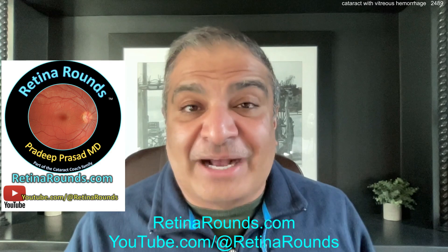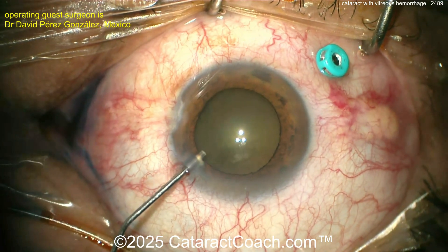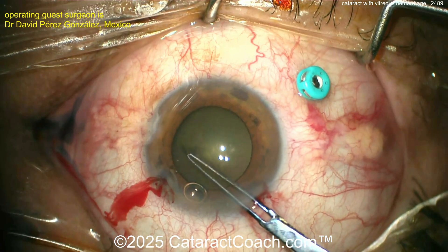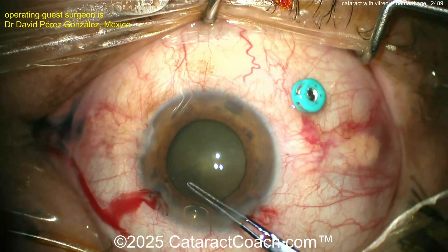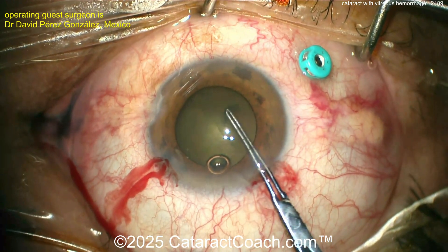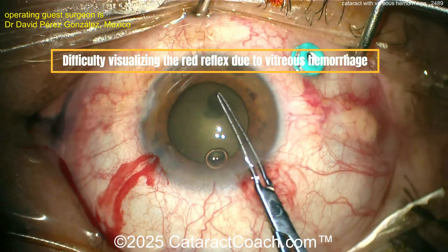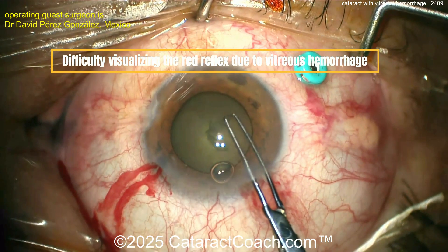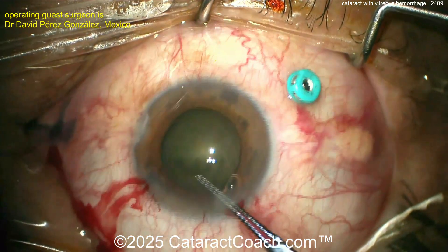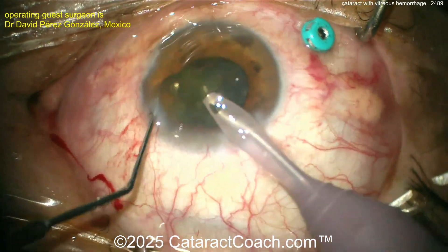Here comes our video of the day. You can see the patient has a real cataract. A trocar is placed pars plana, here comes the main incision, and the capsule has already been stained with trypan blue dye — you can see a little blue dye in the paracentesis. Now getting a good capsulorrhexis — helpful because you've got the blue dye to stain the lens capsule, although it's hard to see because there really is no red reflex due to that vitreous hemorrhage.